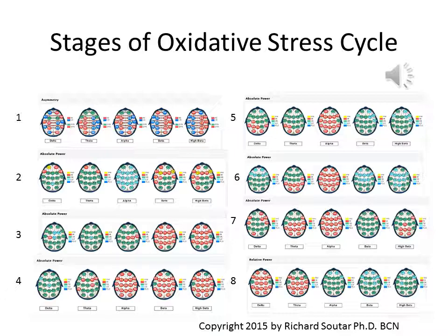If we look at stage 3, we can see that at a certain point, beta completely dominates the map. And we can see that the alpha is starting to come back to a normal state of affairs. This is because alpha is actually increasing at this point due to slowly tiring sodium pumps. As we move into the next stage, stage 4, we begin to see that the alpha is actually increasing in a diffuse pattern across the entire scalp.